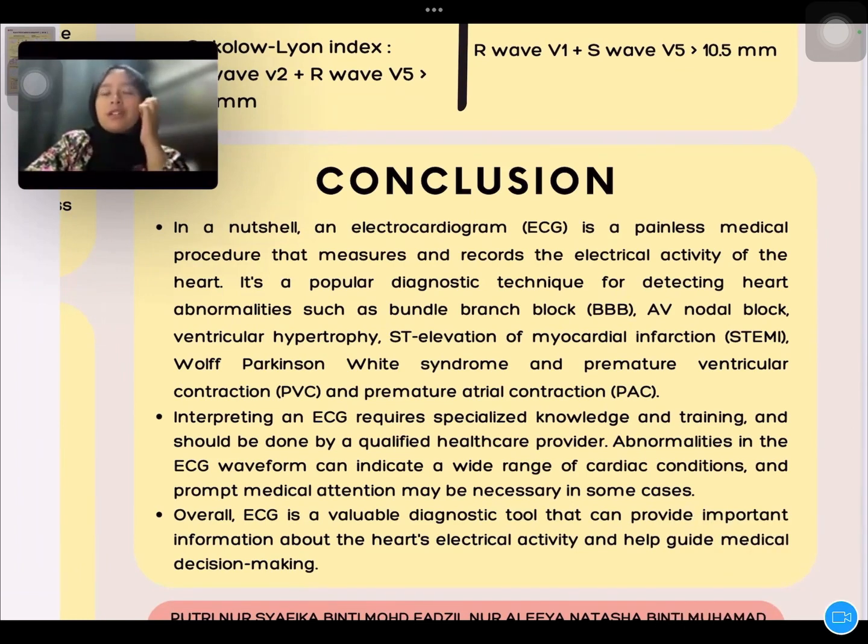In conclusion, a non-invasive medical test that monitors and documents the electrical activity of the heart is called an electrocardiography. It is used for the detection of heart issues such as bundle branch block, AV nodal block, ventricular hypertrophy, STEMI, WPW, PAC, and PVC.